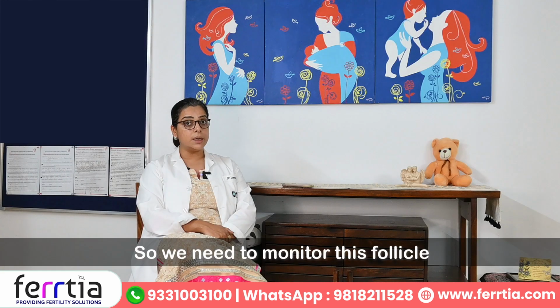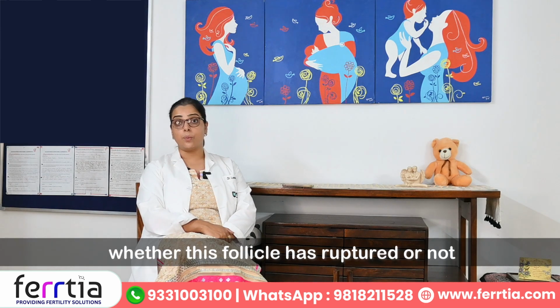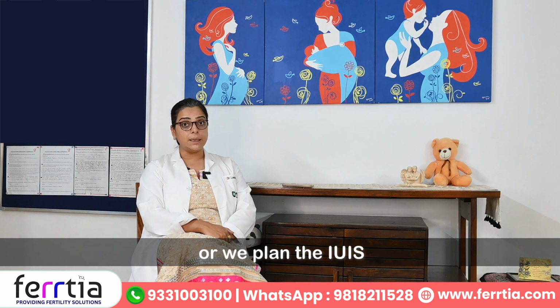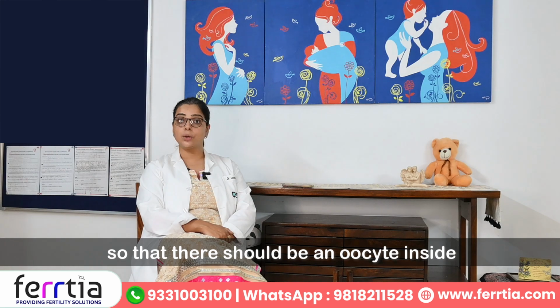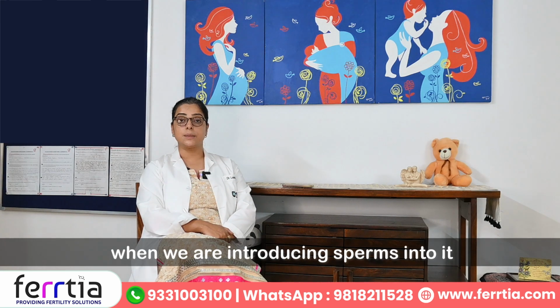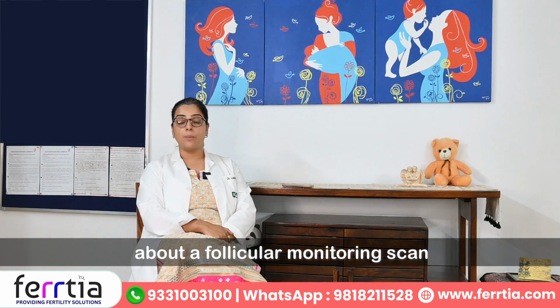So we need to monitor this follicle and see whether, after the ovulatory trigger, it has ruptured or not. If the follicle has ruptured, we plan the timed intercourse or we plan the IUIs around the follicular rupture, so that there is an oocyte inside the uterus when we are introducing sperms into it. So much is important about a follicular monitoring scan.